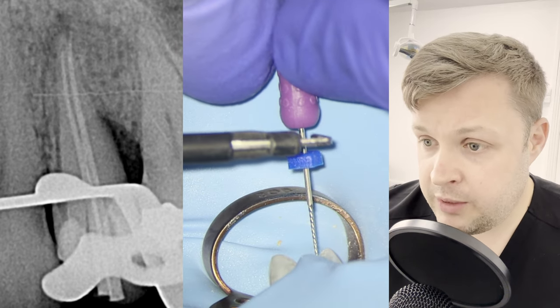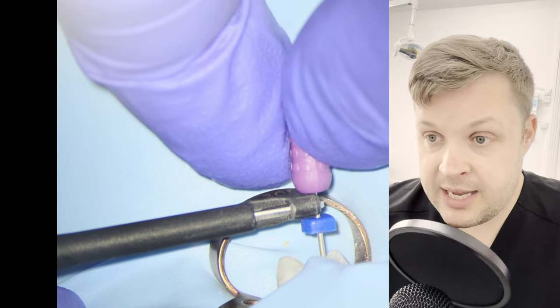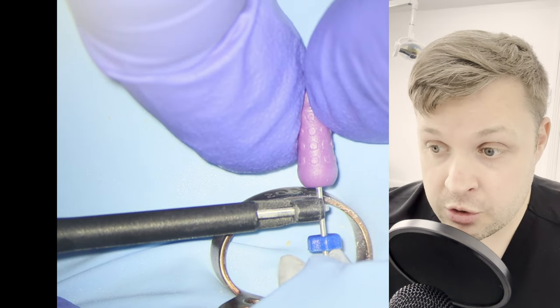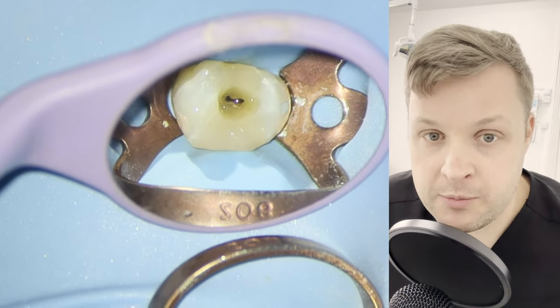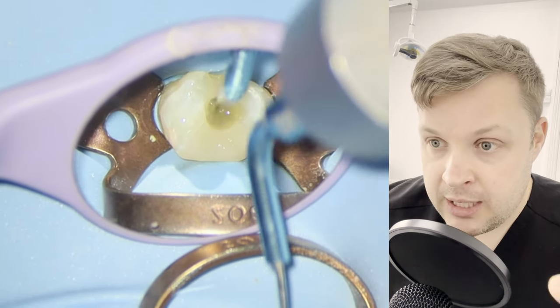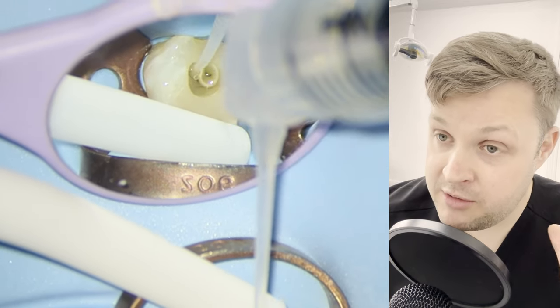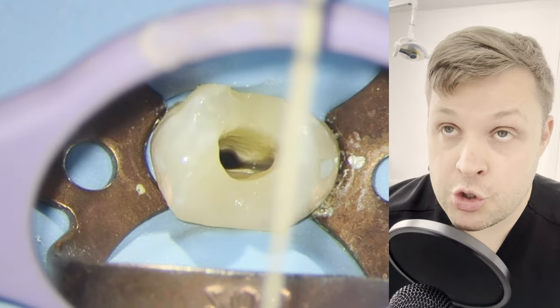We check the working length in both canals. I get the GP points and make sure they are both the same length at the working length mark, usually on the cusps. I am convinced it's at the right length. So I'm going to make a command decision here — with experience, I'm going to trust the apex locator over the radiograph. Some people might be uncomfortable with that, but in real life you should just really trust your apex locator, especially if you've got a good one. They can be more truthful than a radiograph.